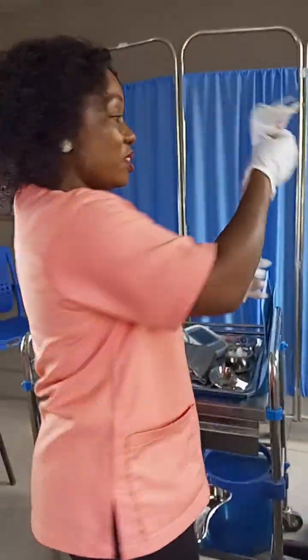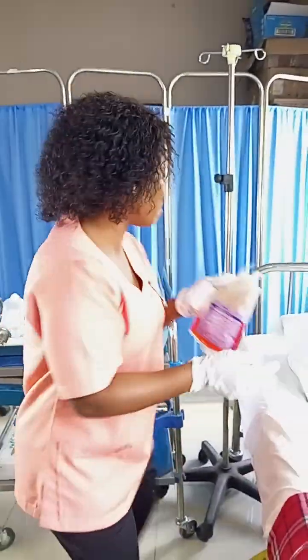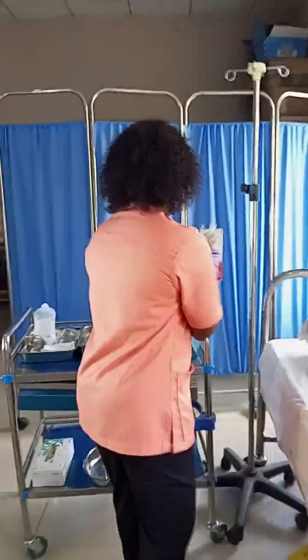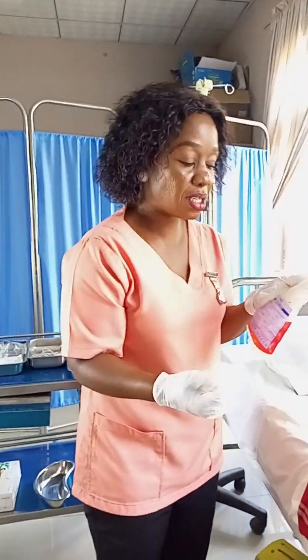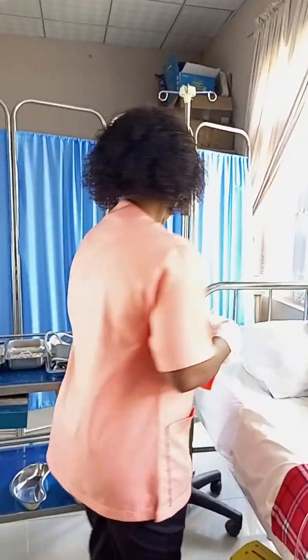Don't forget, before the transfusion, one of your responsibilities is to check the patient's blood group. Does it match with the patient's blood group in the file? Then also check all the investigations. For example, HIV. Is this blood HIV negative? Hepatitis negative? As I mentioned, the rhesus factor, also you check. All the necessary information, you check it and cross-match it with the patient's information from the lab. So now I have done all this and I've checked it's okay.